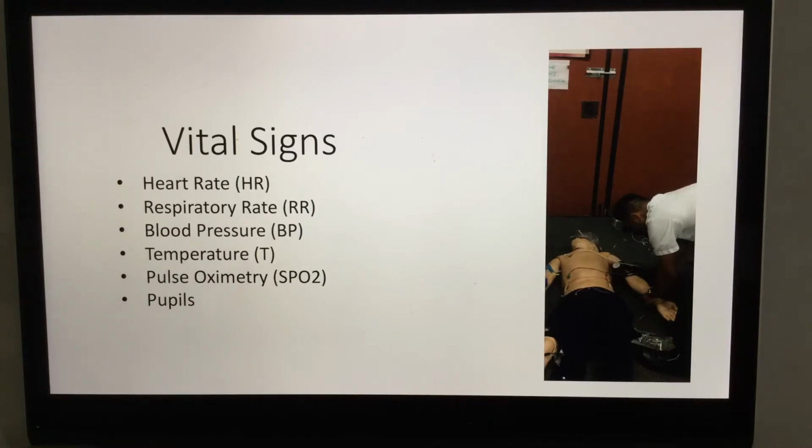Record that number. It should be the highest number. It's your start sound, the systolic number. The done sound, when there's no sound left, there's no ticking, it's done, is your diastolic. Record that number. It should be a lower number than your start number. Your done number is lower than the start number. The start number is your systolic number. Your done number is your diastolic. You have a fraction, systolic over diastolic, and that's your blood pressure.